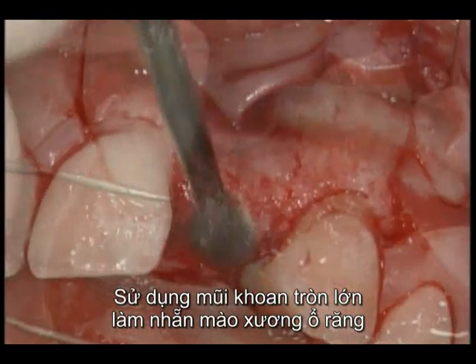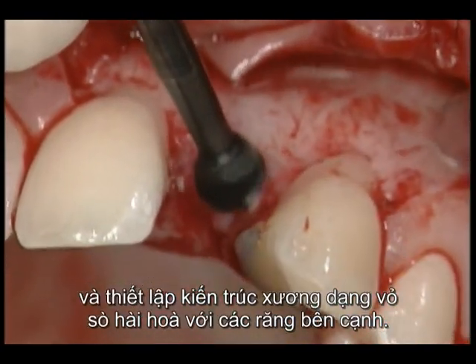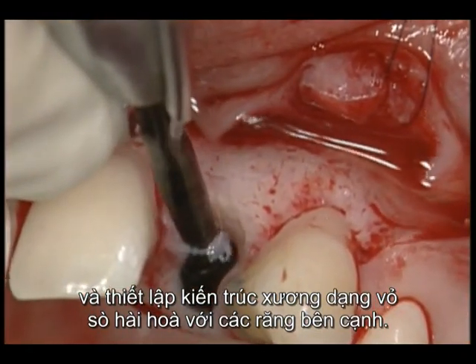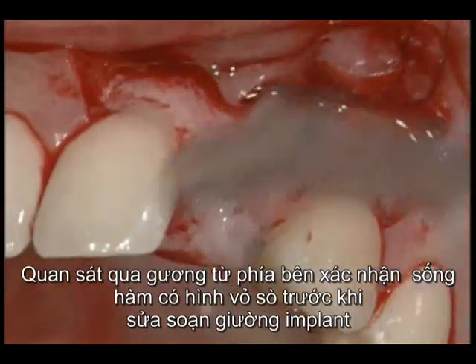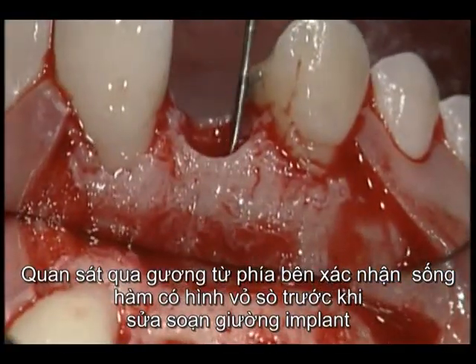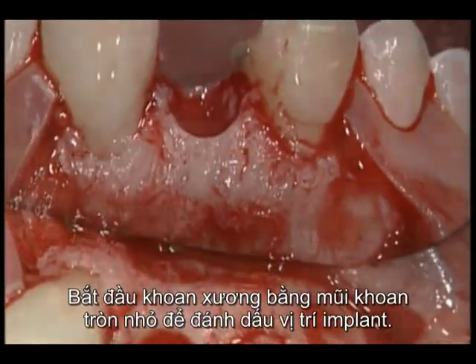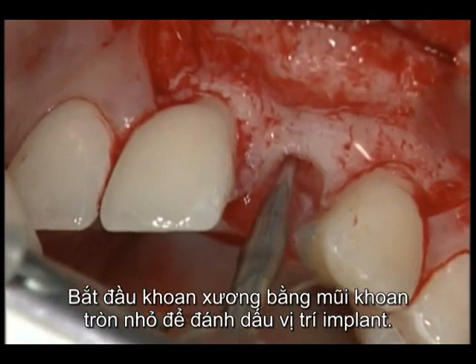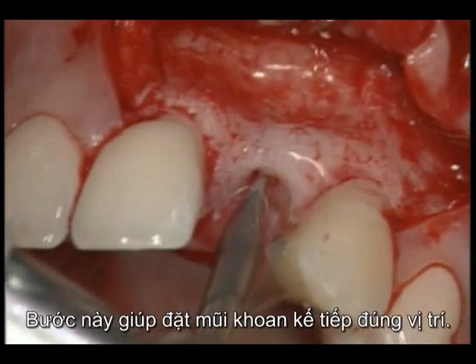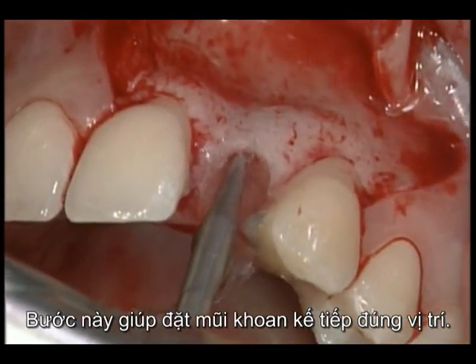A large round burr is used to smoothen the alveolar crest and establish a nicely scalloped bony architecture in harmony with the neighboring teeth. The lateral view in the mirror confirms the scalloped alveolar ridge before the implant bed is prepared. Bone preparation starts with a small round burr to mark the implant position. This step makes it possible to correctly position the next drill.